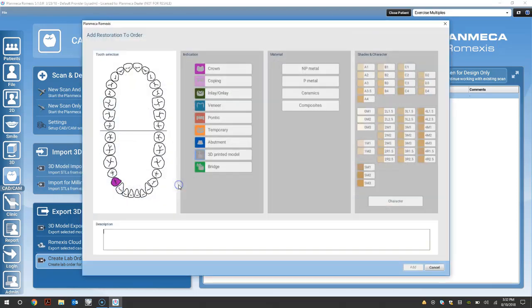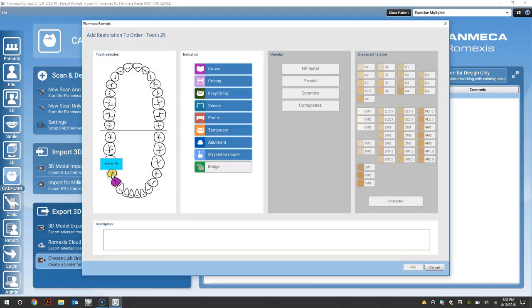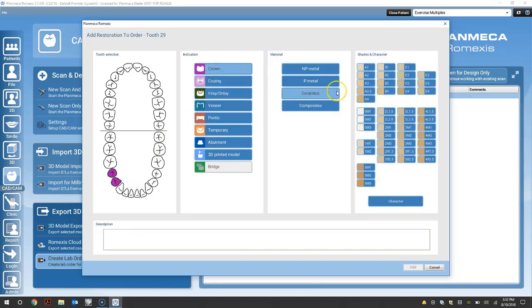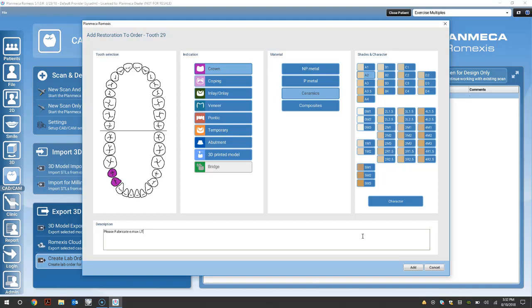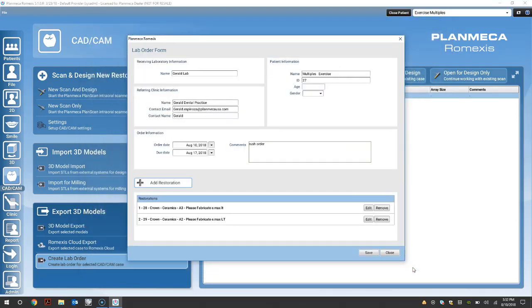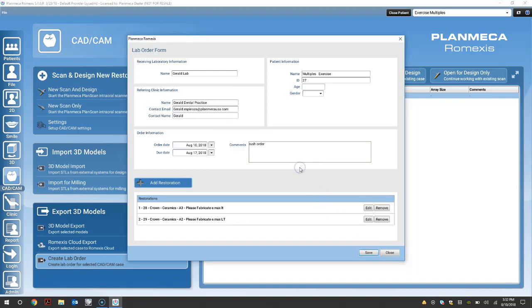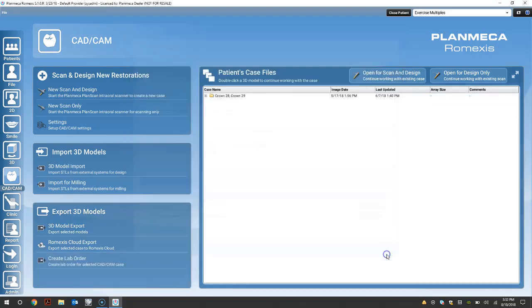And select add. Add another restoration if you have a multiple case. And select the second tooth, the indication, the material, and the shade. And the description for that restoration. Select add. And save your lab order. Click OK. And close.